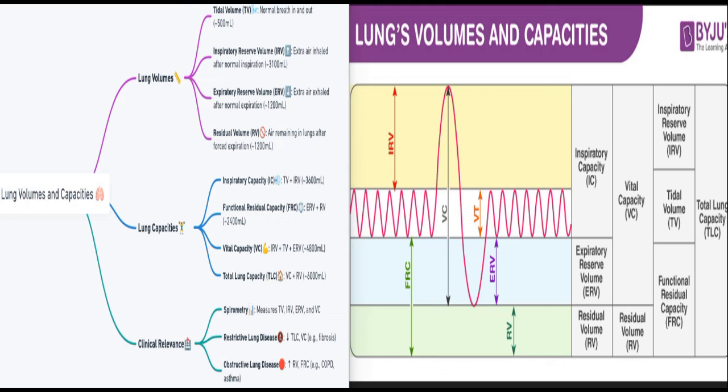Also, evaluation of response to therapy, for example reversibility of airway obstruction with bronchodilators, and monitoring drug therapy for drugs with significant pulmonary toxicity, for example amiodarone and methotrexate, as well as post-operative assessments, like assessment for suitability of lung resections, spine surgeries, and hepatobiliary surgery.